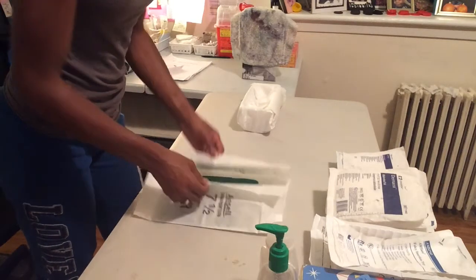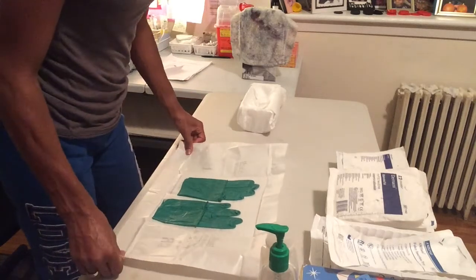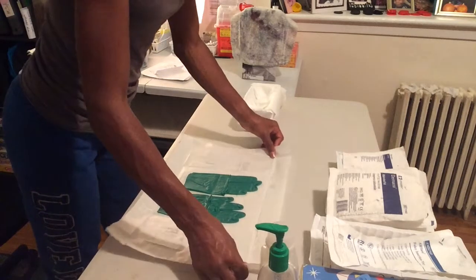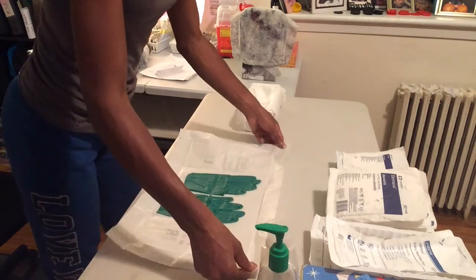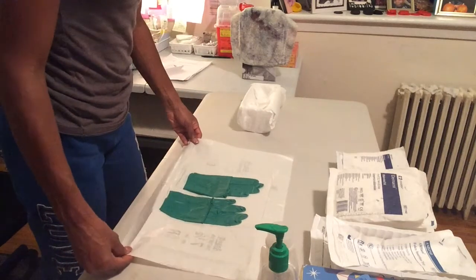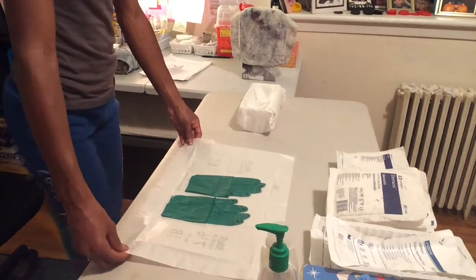I'm being mindful to touch only the edges of this package to keep it sterile. I'll move that gel closer to the edge so I don't have to reach over the sterile field.